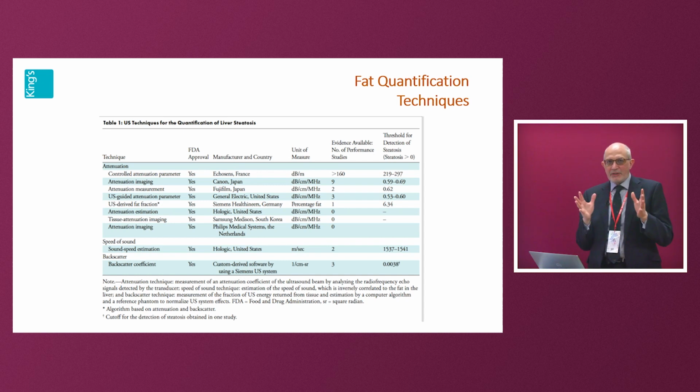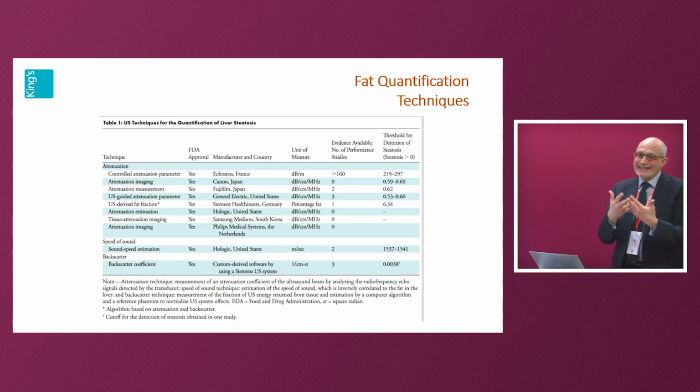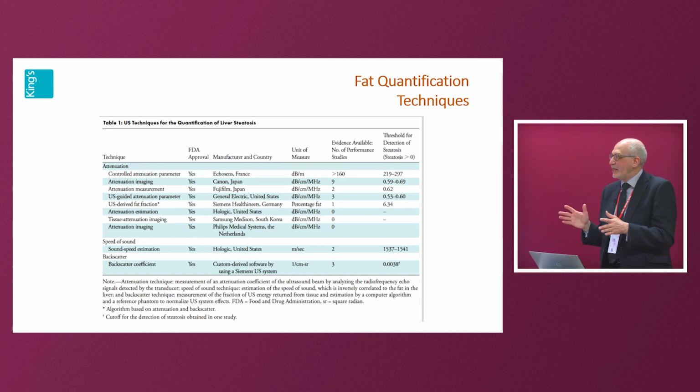But it's established hepatology practice, and it's been around for 20 years. The first paper was published in 2004 in Ultrasound in Medicine and Biology, and since then it's caught on. But the FibroScan can also measure the controlled attenuation parameter, and it can give you a measurement of fat as well. So that is there and is being used.